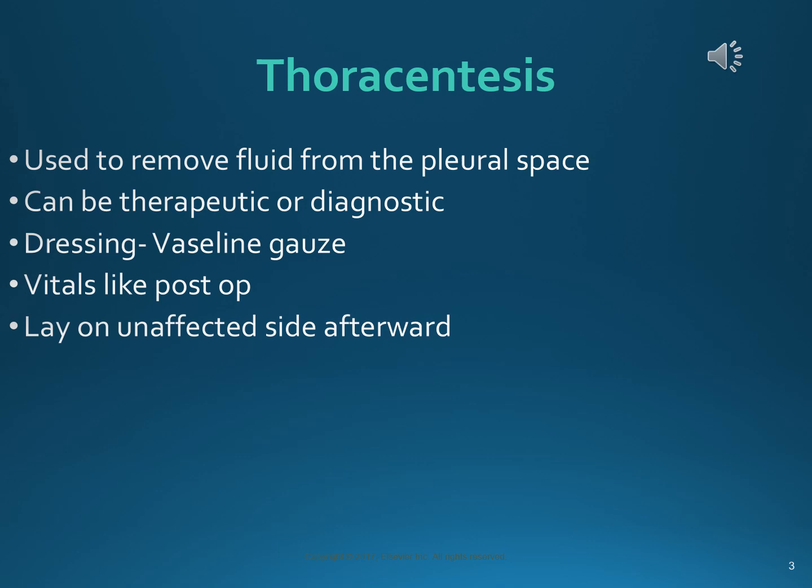Therapeutic means you're removing the fluid to make it easier for the person to breathe and to have their lung expand more fully. If it's diagnostic, that means that they are pulling the fluid off and they're going to send it for tests to figure out just exactly what the fluid is. Is there infection there? Are there cancer cells there? And if it is diagnostic, you may have to assist with gathering the fluid specimens.